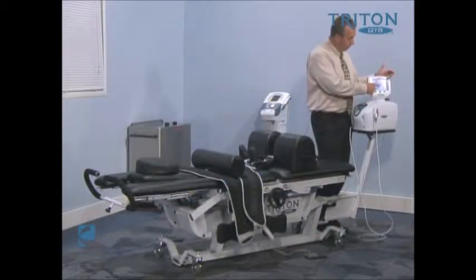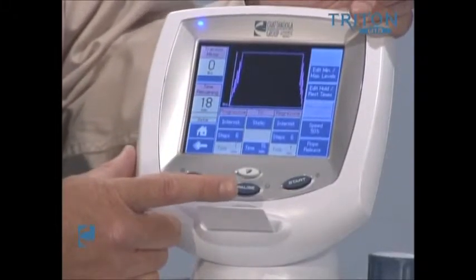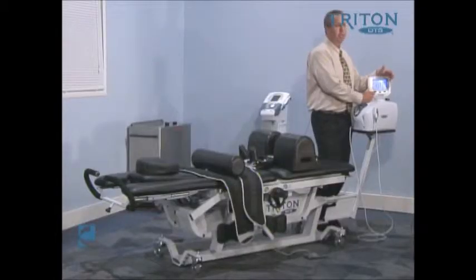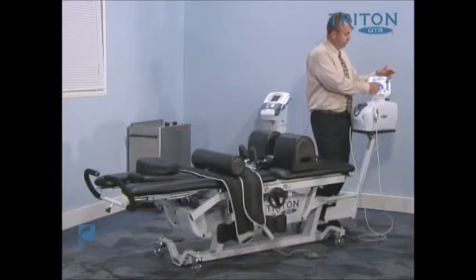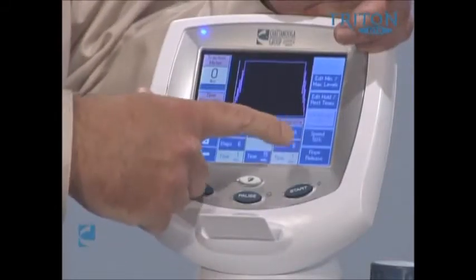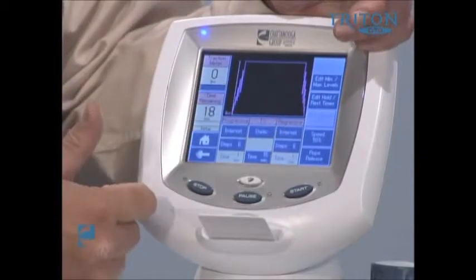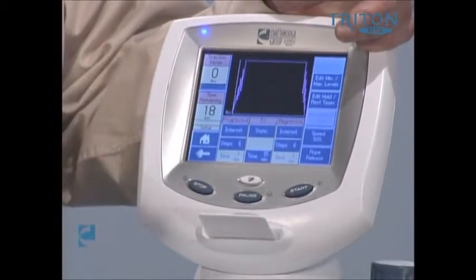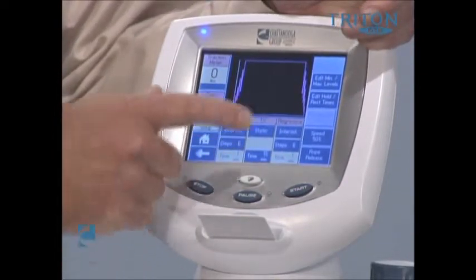We also have the opportunity to change from intermittent to cycle to static when it comes to the actual treatment. We can change the treatment time as well to match a particular protocol. For the regression phase, very similar to the progression phase, we can change it from static to intermittent and also change the number of steps involved.